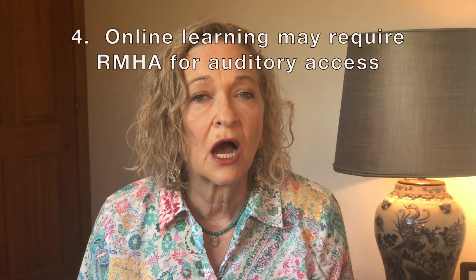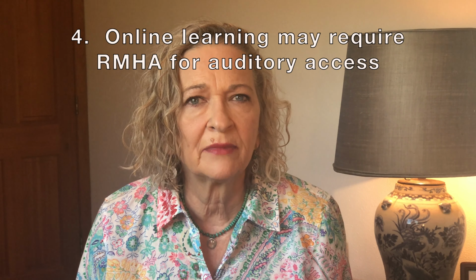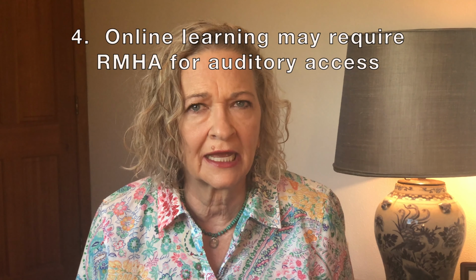4. Online learning may best be accessed by a student with hearing loss when using their RMHA connected to the online device. Next time, we will explore captioning for online content.